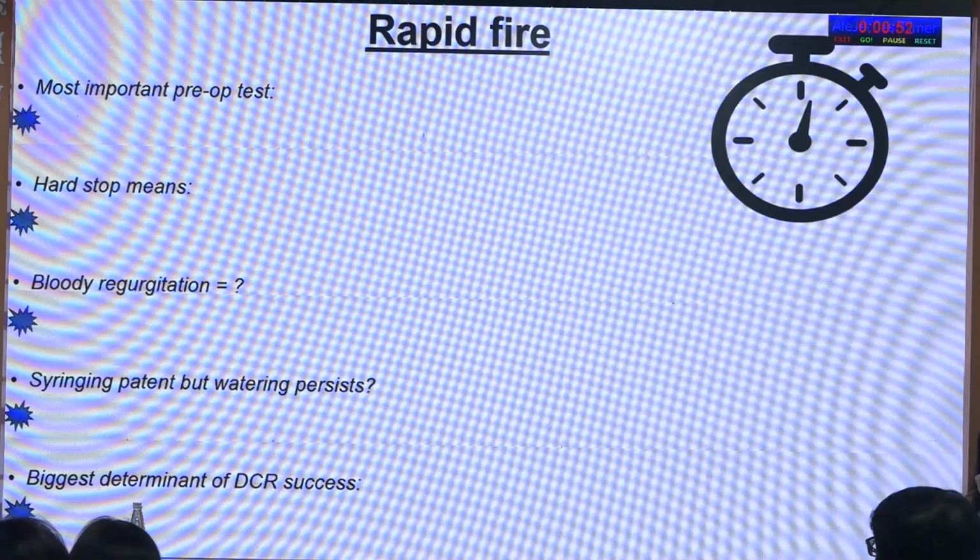So what is the most important preoperative test? Here, the lacrimal syringing. And what does hard stop mean? It means that the canaliculus is patent. Now what does bloody regurgitation signify? Here we have to rule out a lacrimal sac tumor.